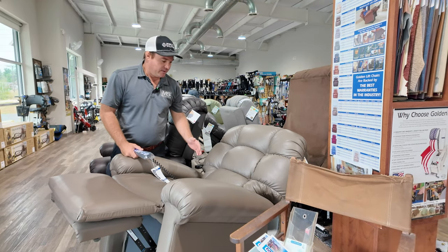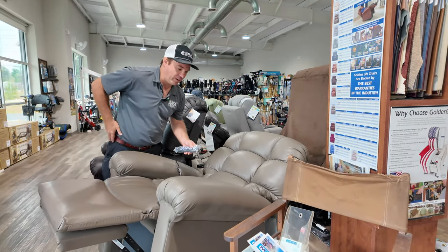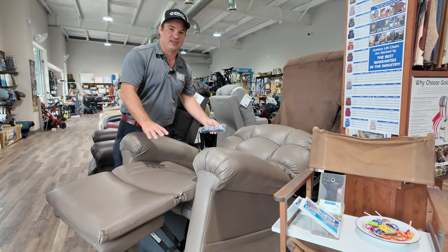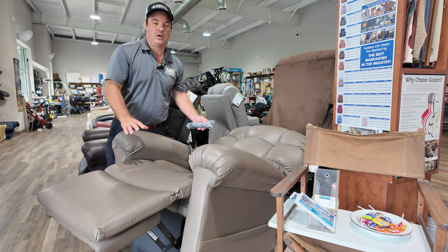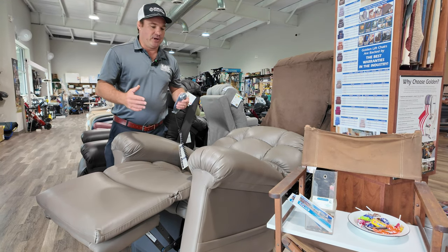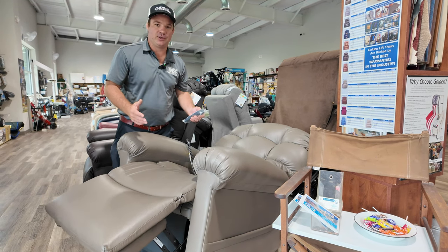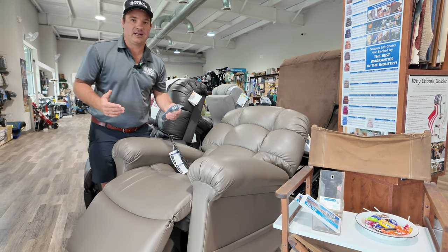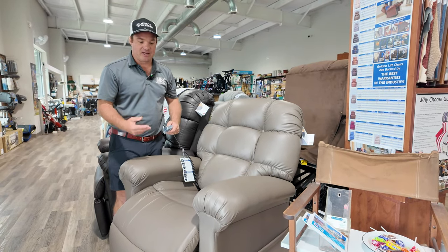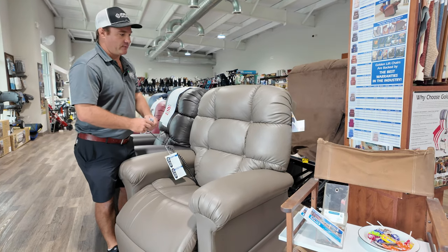This can put you in a true zero gravity to take the pressure off your back, redistribute to your shoulders, really rejuvenate your body. This is the position you would love to get into. If someone's in a chair all day long, you need to get them in different positions to distribute the weight. Any chair with twilight technology is going to allow you to do that. I like this one the best. It comes in two different sizes, it's customizable with different fabrics, and you can add heat and vibration to it.